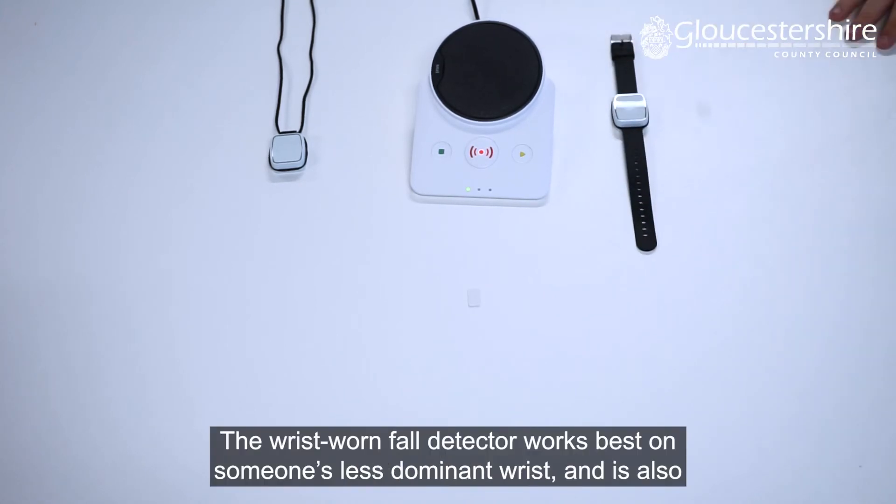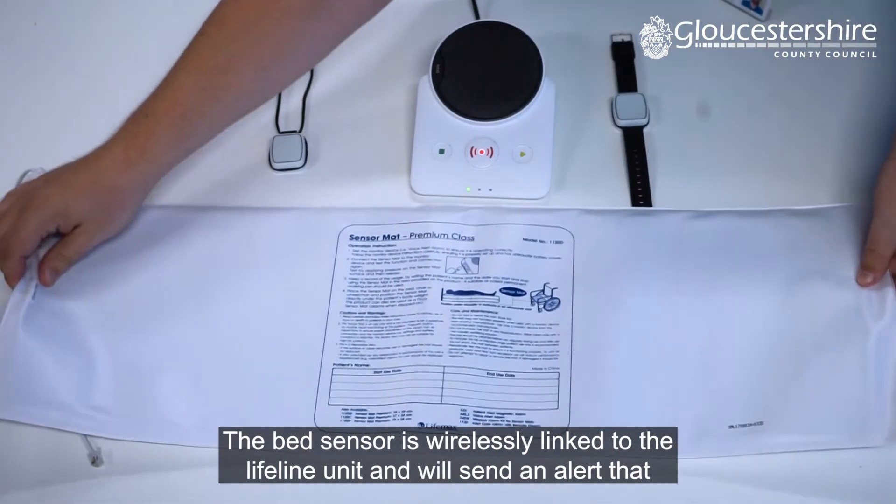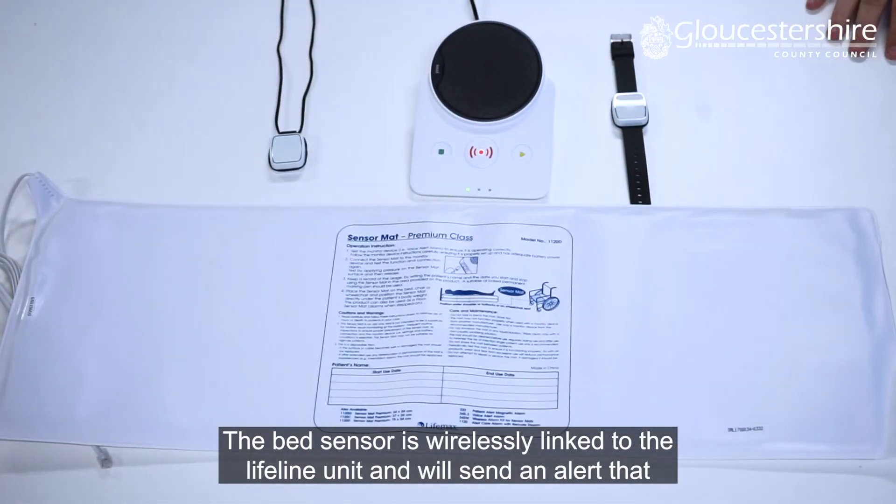The wrist-worn fall detector works best on someone's less dominant wrist and is also designed to detect serious falls with significant impact from a standing position.